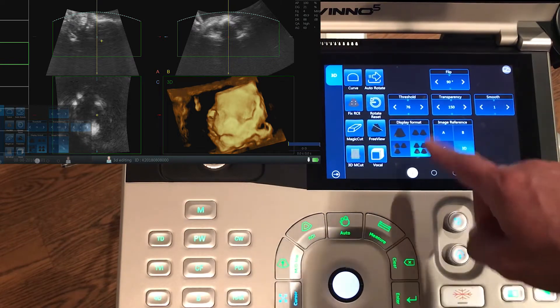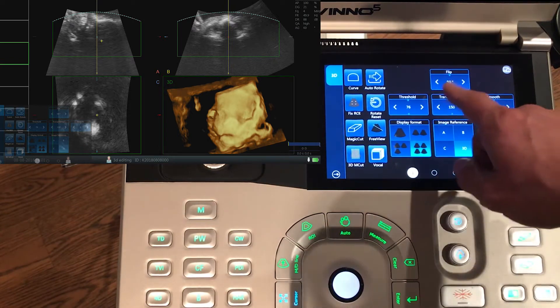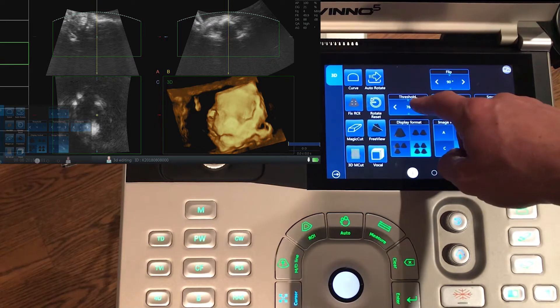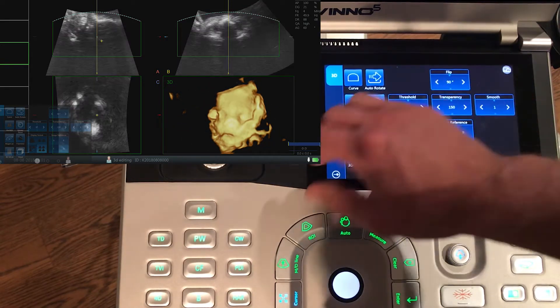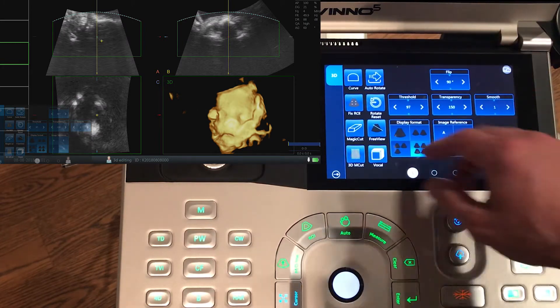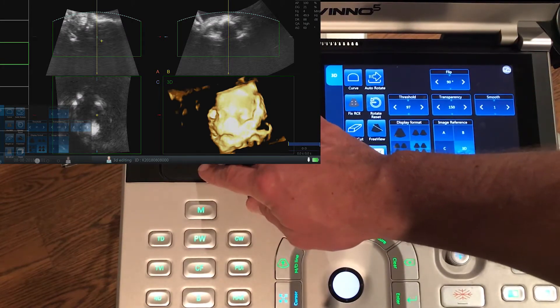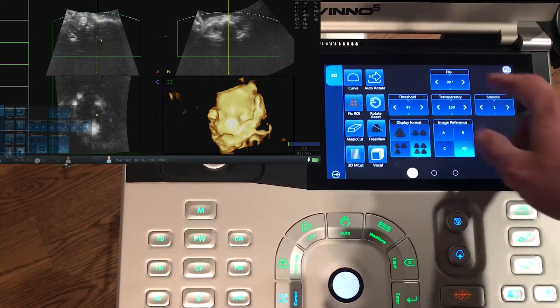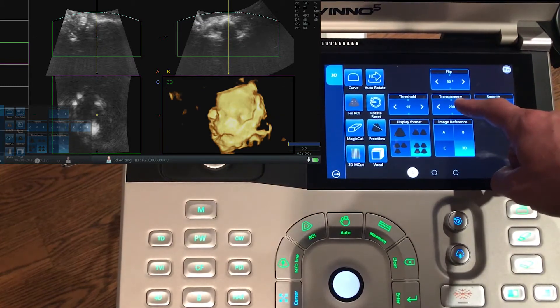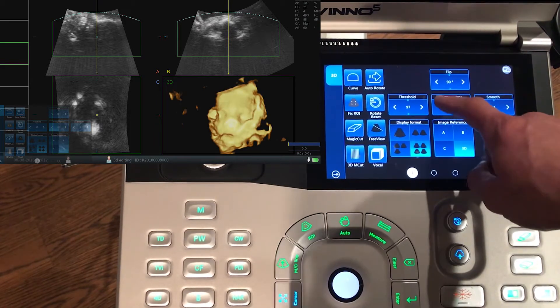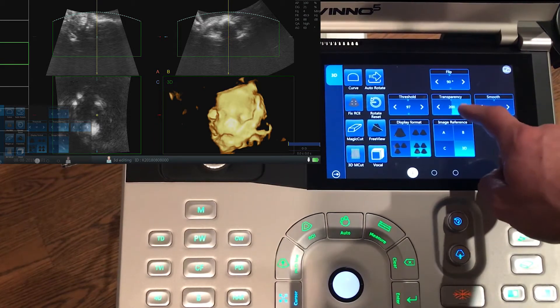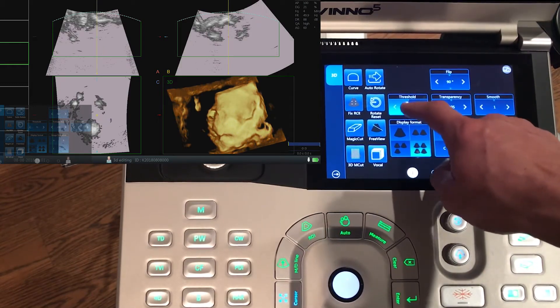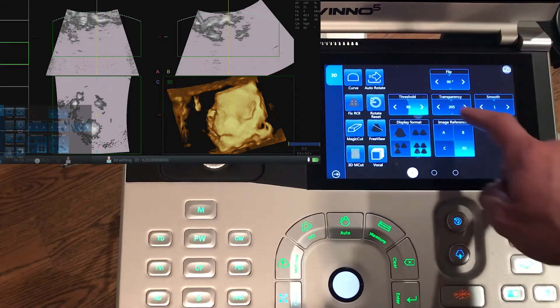Let's go back to the 3D. The first couple of things I usually look at when optimizing the parameters is the threshold — usually it should be somewhere around 100. I'm going to increase it a little bit and try increasing and decreasing the gain. I'll also bring up the transparency because that looks a little bit low — up around 200. Increasing the threshold didn't work in this case, so I'm going to take it back down to where it was.